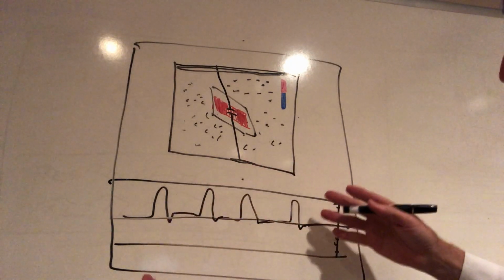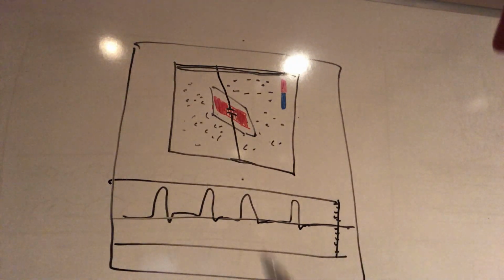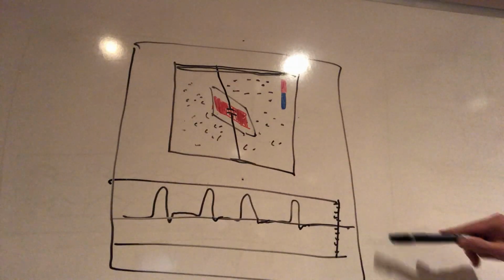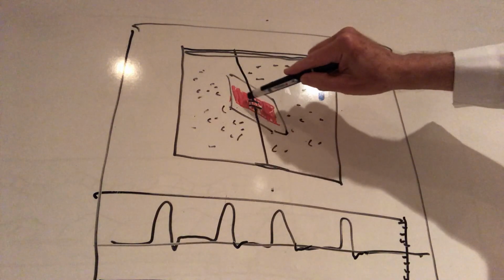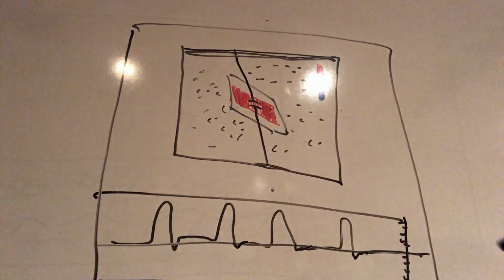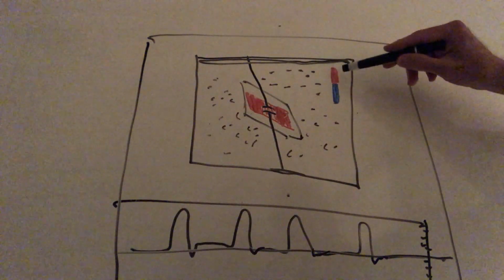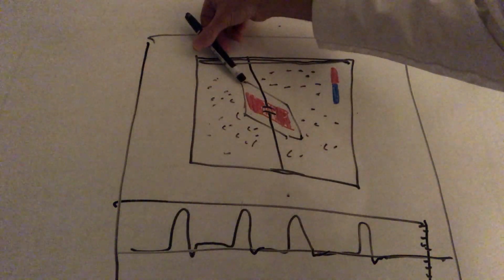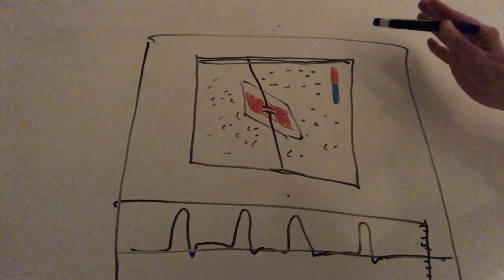Okay, so here's a rudimentary picture of what's going on in the duplex image. There's three things going on. You have your 2D image, you have your color flow image, and you have your spectral Doppler. Okay, what's this? This is your cursor. What's this little area in here? That's your sample volume. You want to have that small. This is your color bar. Your color bar is telling you that red is going towards the transducer. Remember, the transducer is on this point here. So red is towards the transducer, blue is away from the transducer. We're the ones who assign that.